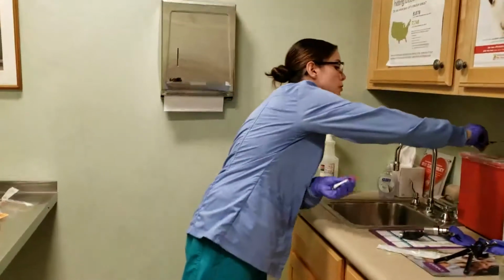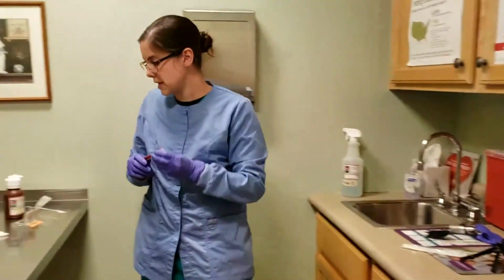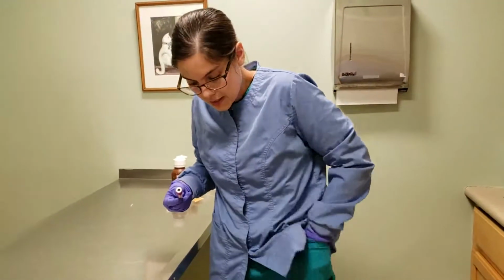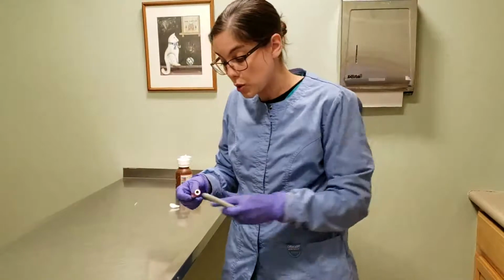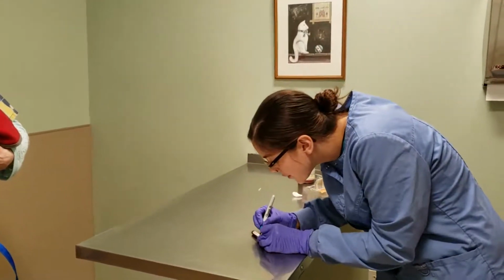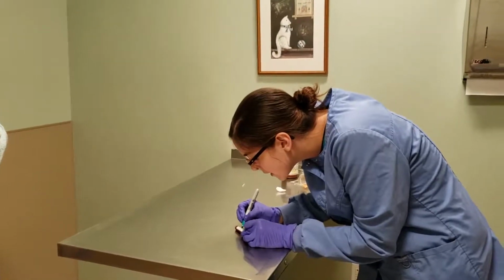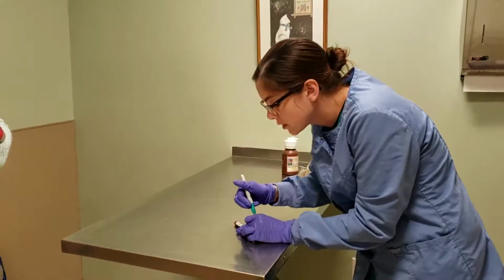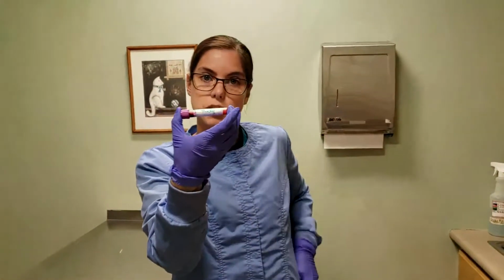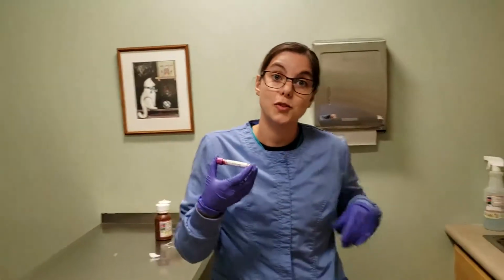Make sure we invert the tube several times to make sure it's mixed. And then we will write his name and a D for donor, so that we know when it's ready, we can differentiate between the two. So we've got Rocky and then D for donor, and now we're ready to spin them down.